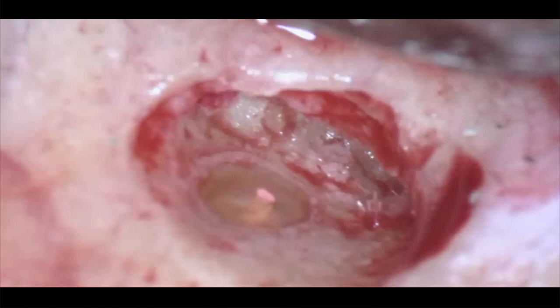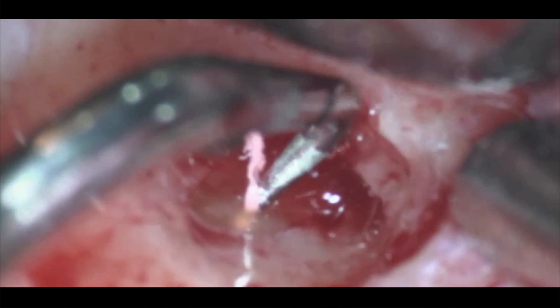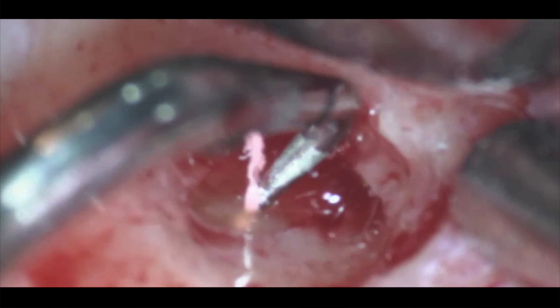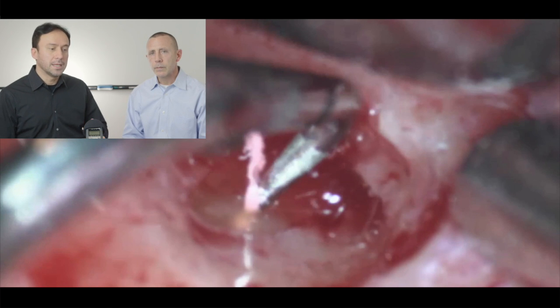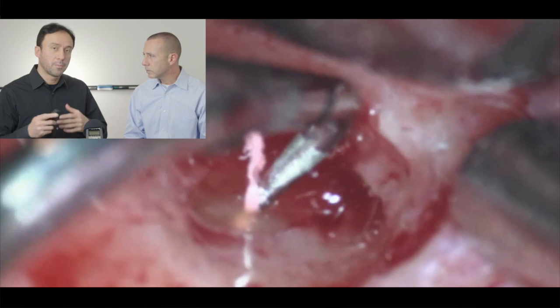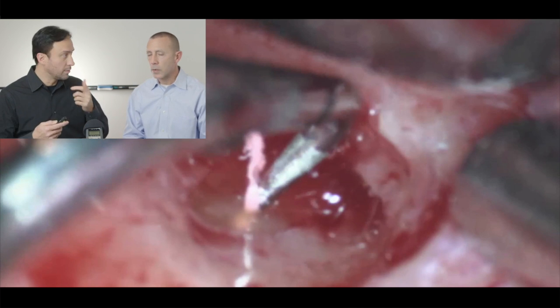The osteotomy was performed and you can see the apex with the filling at the end. We used an ultrasonic to get the retro preparation. Ideally a little larger — deeper and slightly wider in diameter — but we were up against some hard material. Using the lid technique, the bioceramic flowable is injected in, and the preparation needs to be wide enough for the tip of the injection needle to reach all the way down.